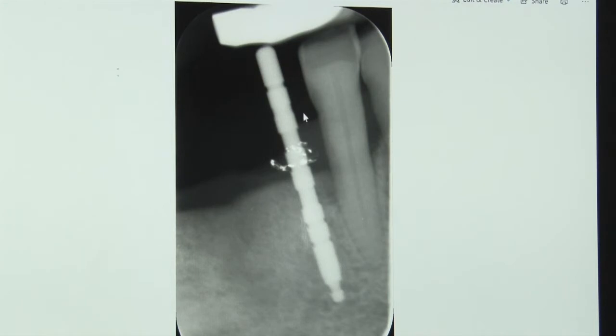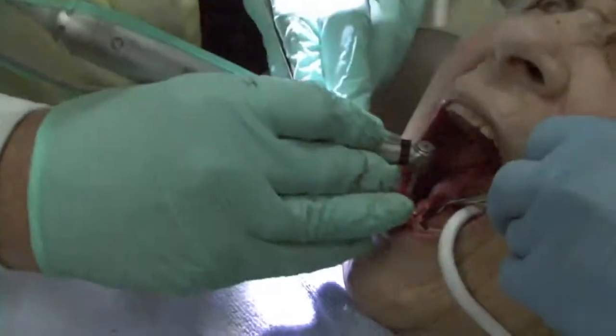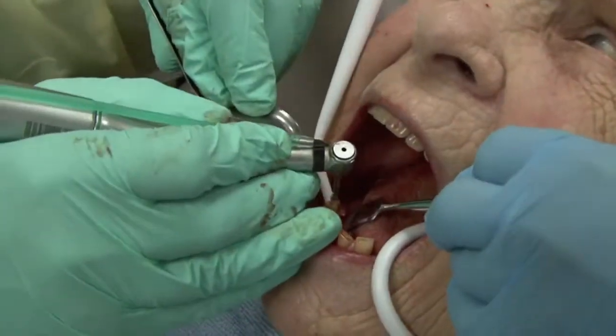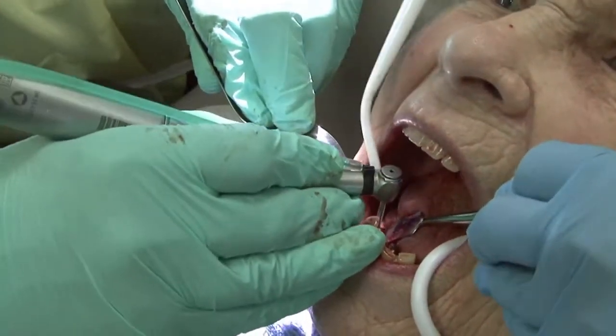Perfect. Okay, guys. We have just inserted the aligning pin in order to see how far we are into the bone and whether or not we are in the correct position. I'm very happy with the position relative to the adjacent tooth. We're down 12 millimeters, and so all I wish to do in this location is to expand the size so that we can place a 4.0 diameter implant. Our round burr is being used just at the orifice, just so that when we put the 2.8 in, we don't have any shaking.